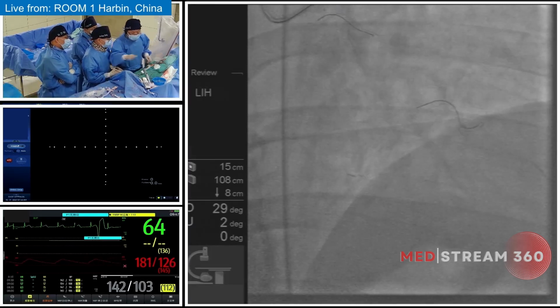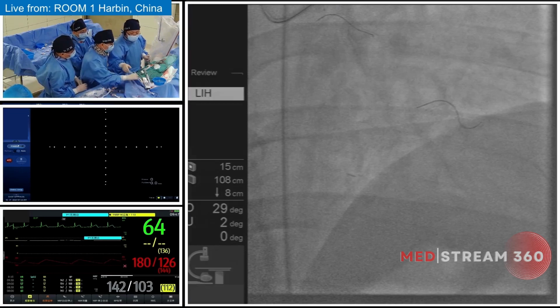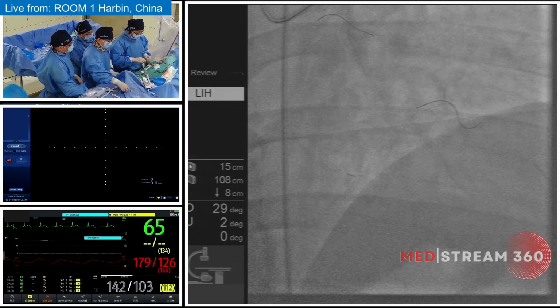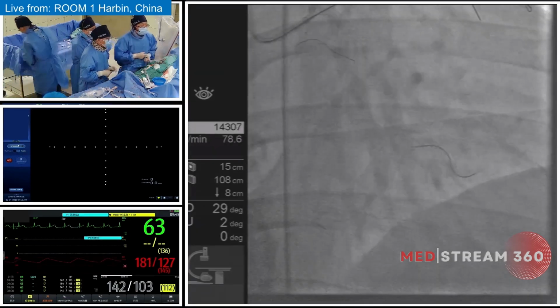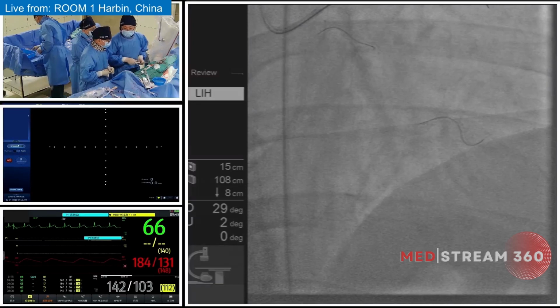Okay, do a super selective angio. Contrast, please. A little more. More, please. Contrast.